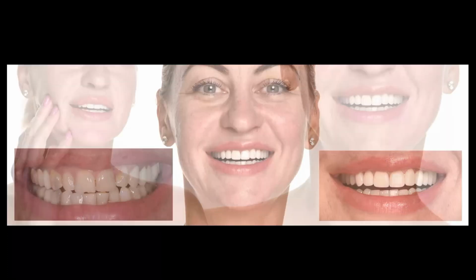We simplified her teeth. We gave her a youthful, rounder shape, but you'll notice that the lateral, especially that number 7, kind of pops out a little bit more at you. And it does that on purpose so I could take away the visual tension on the contralateral side and let it balance out a little bit more. And that's really what our goal is when we're trying to break through the visual tension.